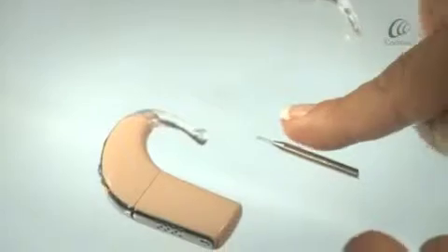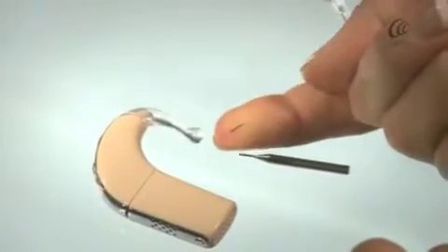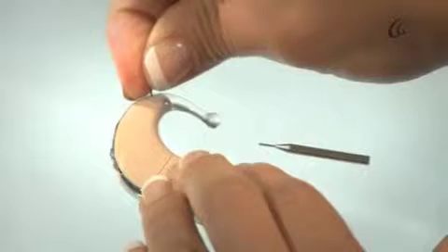Attach the tamper-resistant earhook onto the processor. Insert the earhook pin into the hole.